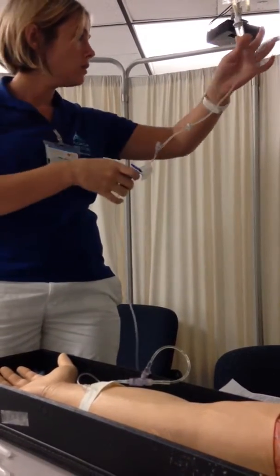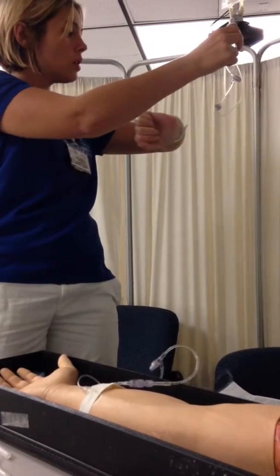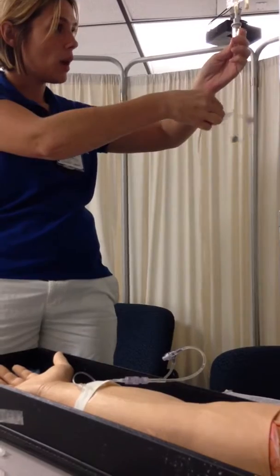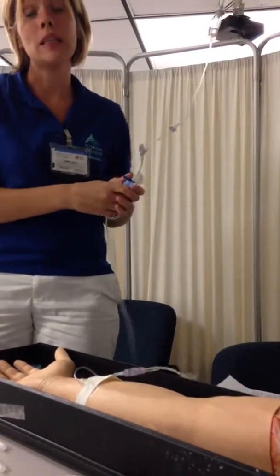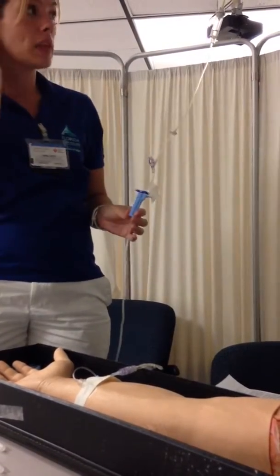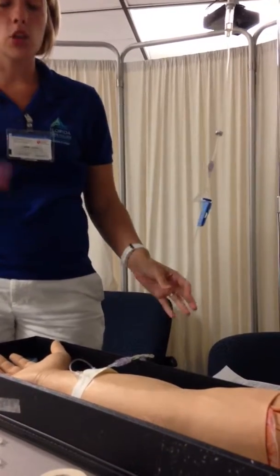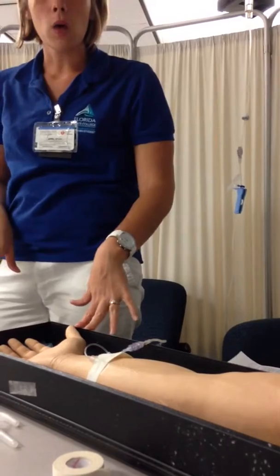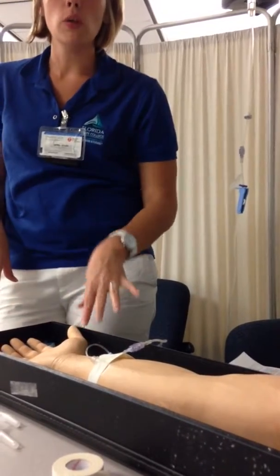I'm going to document as I go: the time, the drug and the route. Now I have it running at 17 drops per minute. So now that I know this medication will infuse over 1 hour, I'm going to document that this dose, 100 mLs, will infuse over 1 hour, and document any intakes or outputs, IOs.